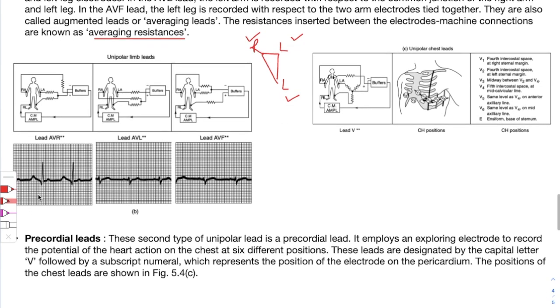Here you can see all the three recordings of the unipolar limb lead placing.